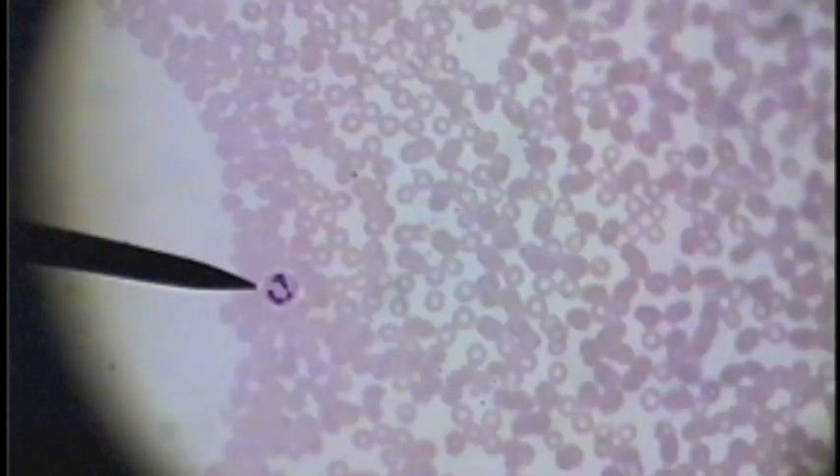Here is another neutrophil. This is a lymphocyte — a nice, round, spherical or circular nucleus with very little cytoplasm apparent.